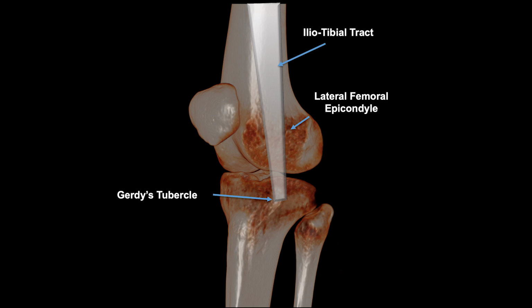At its distal end, it passes close to the lateral femoral epicondyle, which is a potential impingement site in the context of iliotibial band syndrome. In the back is the anterolateral ligament, a thin structure reinforcing the joint capsule that inserts on the lateral femoral epicondyle to terminate on the lateral side of the tibial epiphysis. This structure is often injured during anterior cruciate ligament tears in the form of an avulsion fracture of its distal insertion, which is called a Segond fracture.